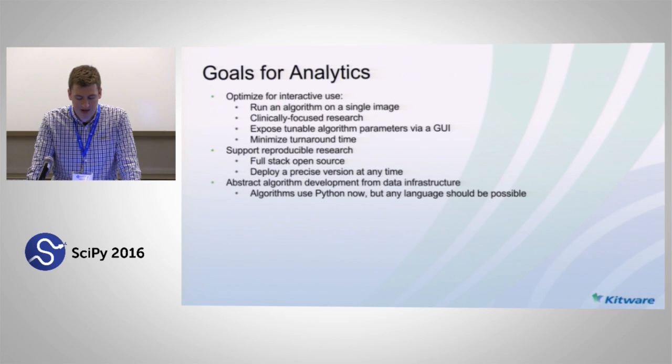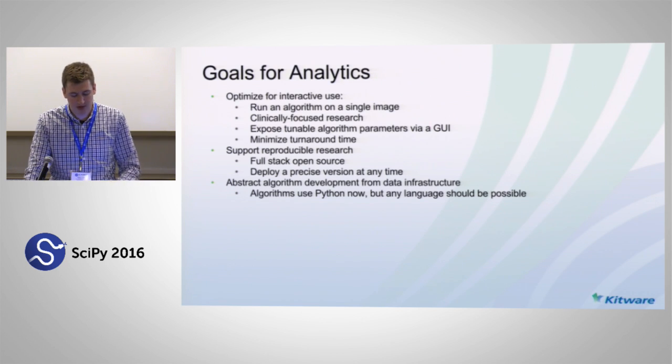But everything we're doing here absolutely applies to broader batch processing and map-reduced data sets where you may actually have correlations between images that need to be considered when you're doing your analysis.